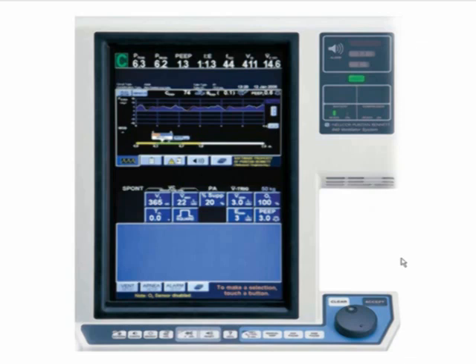It might also say alveolar pressure on some of the vents, but somewhere on it, it will tell you the plateau pressure. What you want to do is just call respiratory, and for your ventilators, have them show you once how to do a plateau pressure. After that, you'll know, and you can do it yourself. And just every 20 minutes, half hour or so, you come to the vent and you do a plateau pressure check. If it's less than 30, you're golden.